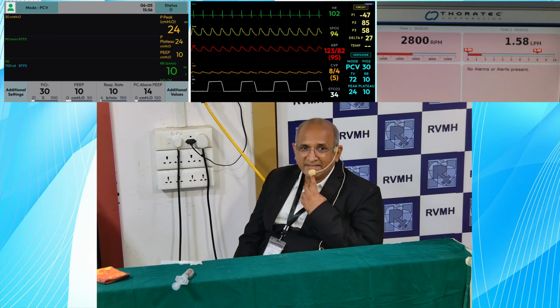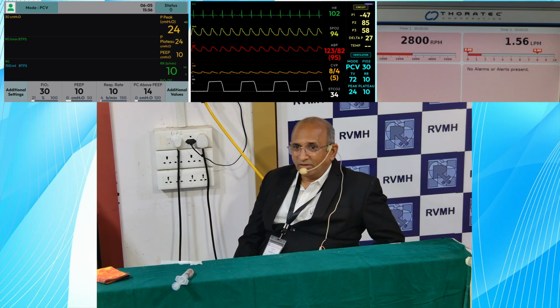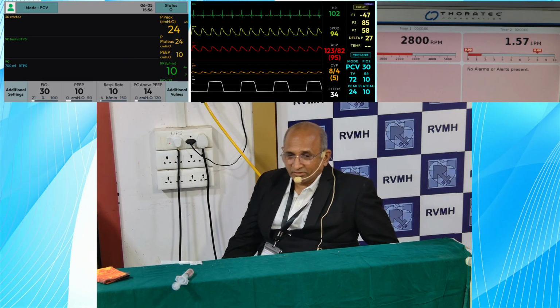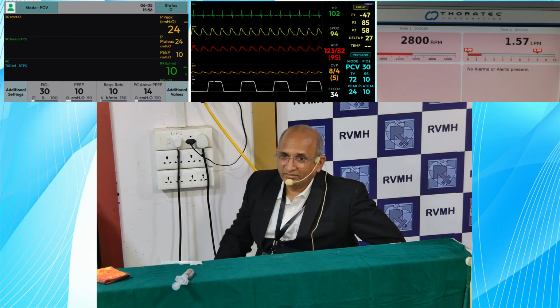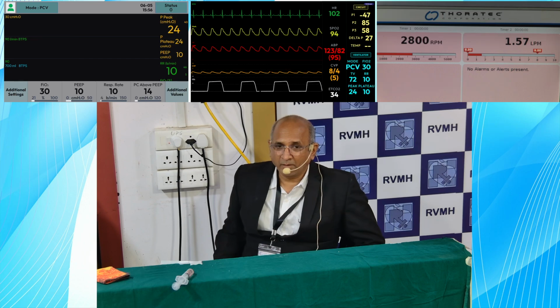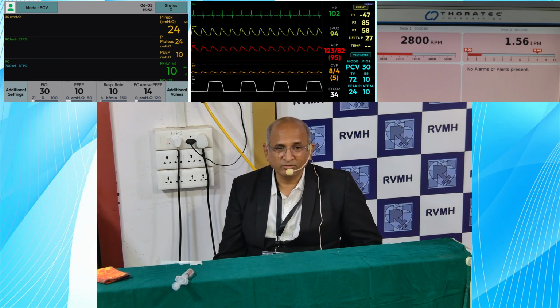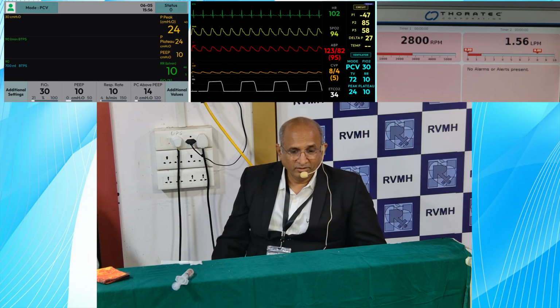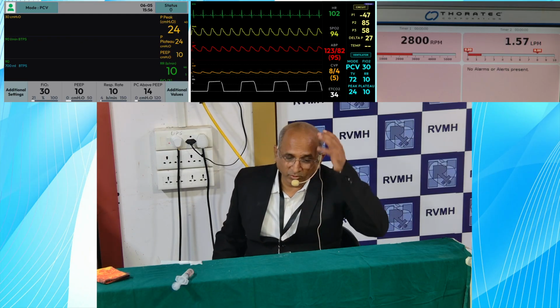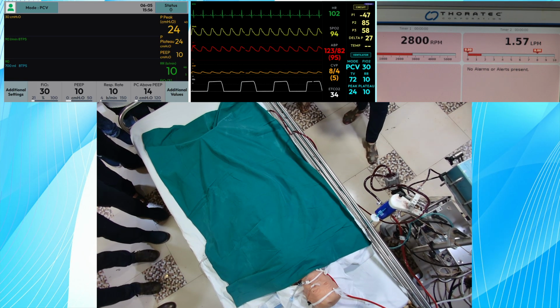He was doing well. Yesterday, while giving nursing care, the cannula got kinked in the drainage limb of the circuit in the railings, and because of that the flow decreased and saturation went down to 60. There was a hypertensive response and tachycardia, but it was diagnosed immediately, so things settled down immediately. Okay. Now, these are the parameters you can see on the monitor. It's over to you. Now it's your patient. You have to monitor the patient and decide what you need to do.